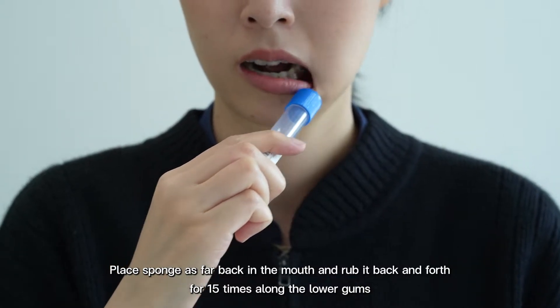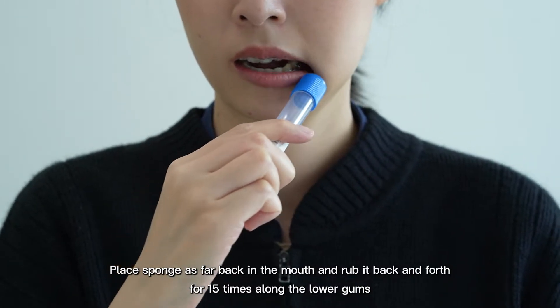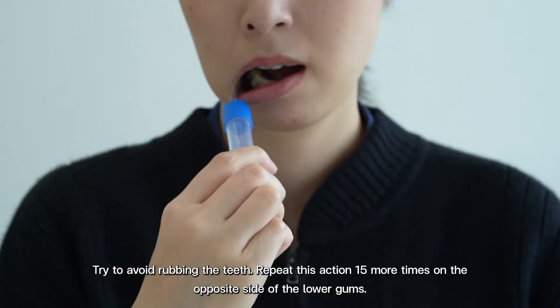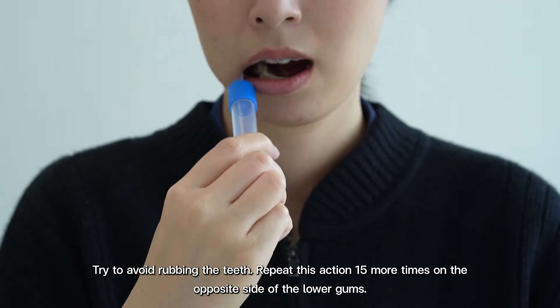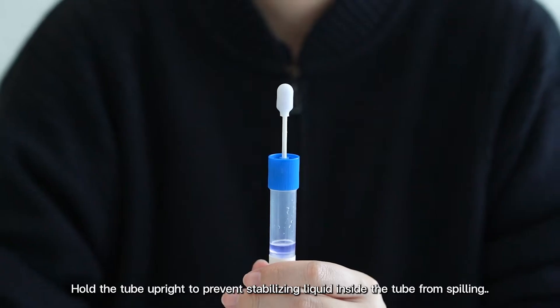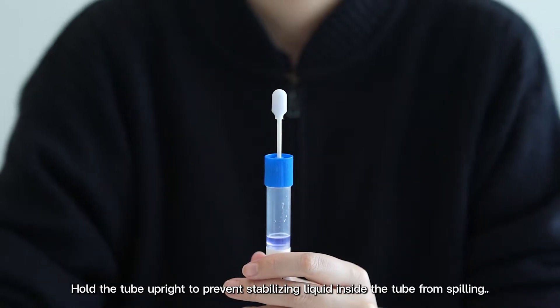Rub the swab back and forth 15 times along the lower gums, trying to avoid rubbing the teeth. Repeat these actions 15 more times on the opposite side of the lower gums. Hold the tube upright to prevent the stabilizing liquid inside the tube from spilling.